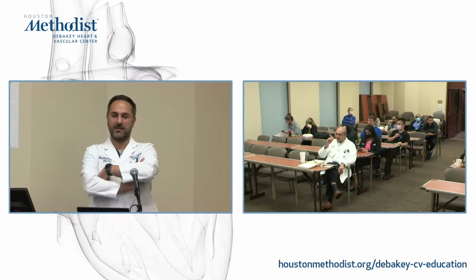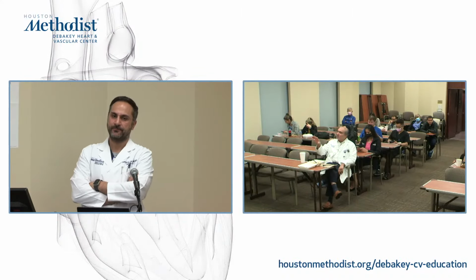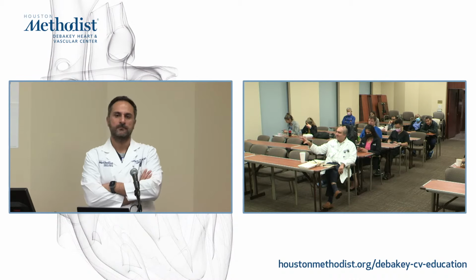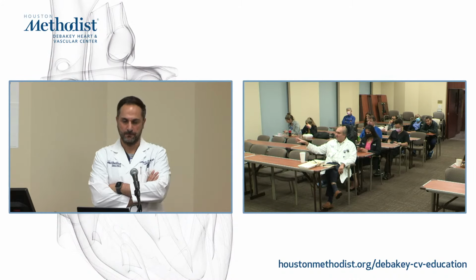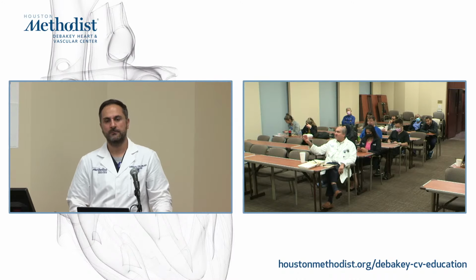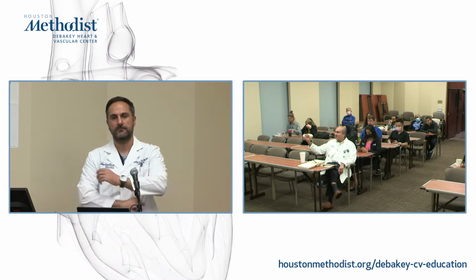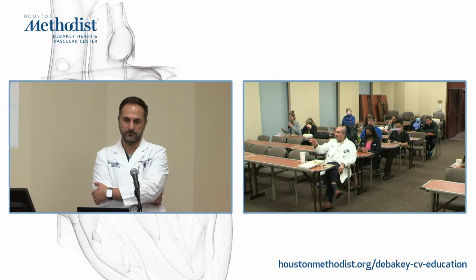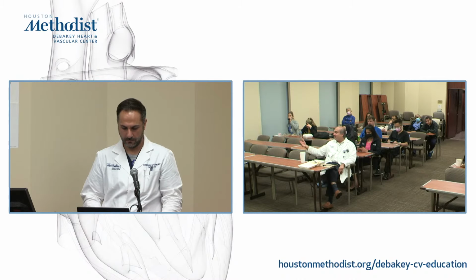So, Carlos, let me ask you. You showed some stuff on thrombus, right? How MRI is more sensitive for thrombus than echo. Yep. And it's important to make a distinction. It's not so much MRI itself, it's the contrast MRI. If you look at cine MRI, it does a little bit better than echo to get better visualization. It doesn't pick up all of these, especially the mural thrombi as well.